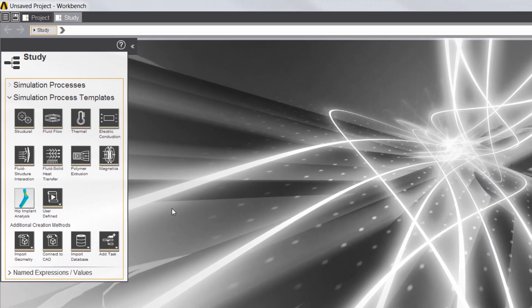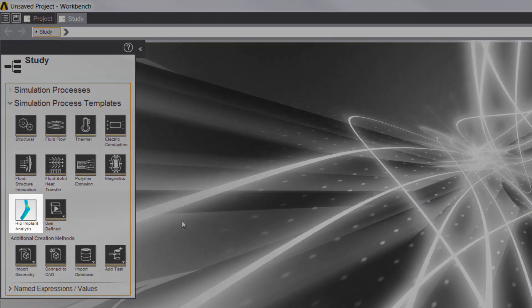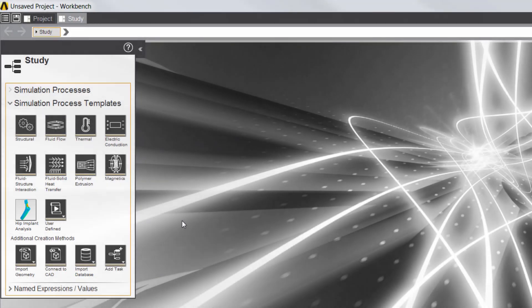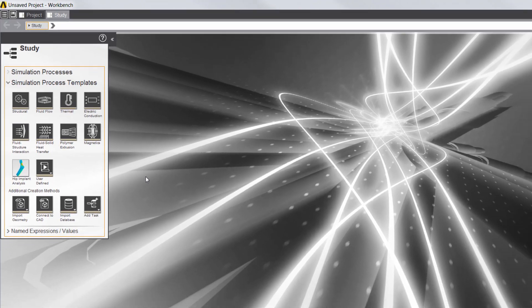In this video, I'll use a custom application to evaluate the linear static stress in a hip stem implant based on an ASTM standard.